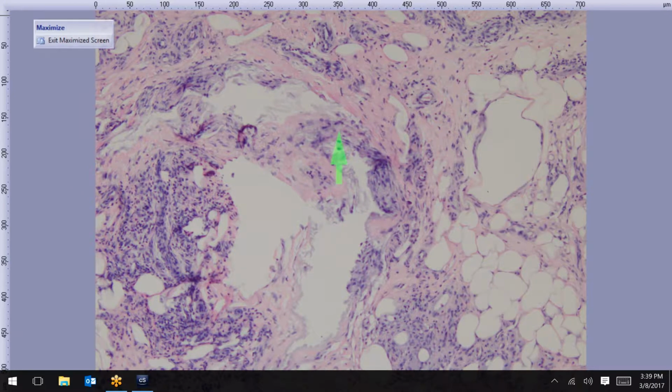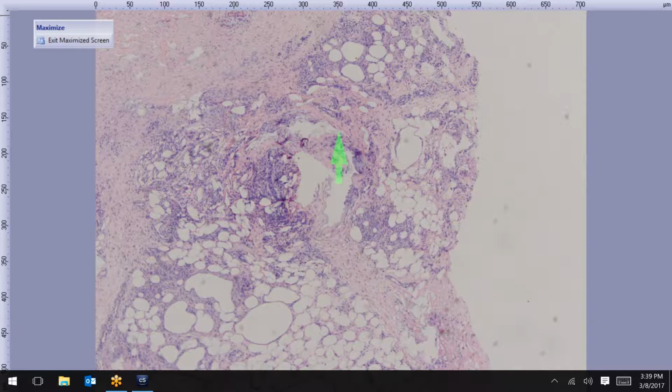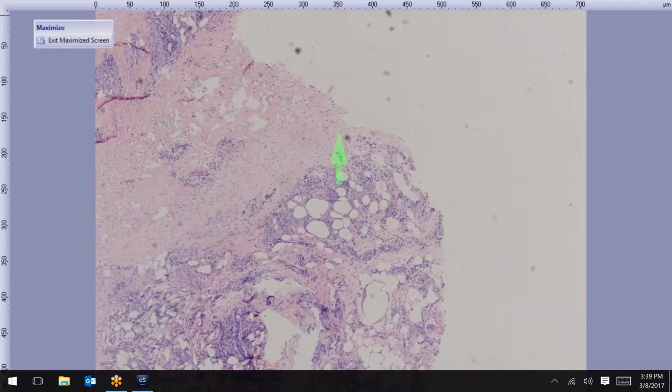And when you see that, the diagnosis in the context of all that history is, and it goes by a few different names, lipodermatosclerosis is the condition, otherwise called sclerosing panniculitis. And I think there's a few other names, hypodermatitis sclerodermiformis, but I think lipomembranous panniculitis or sclerosing panniculitis or lipodermatosclerosis are the main names. So that's a pretty nice classic case of that.